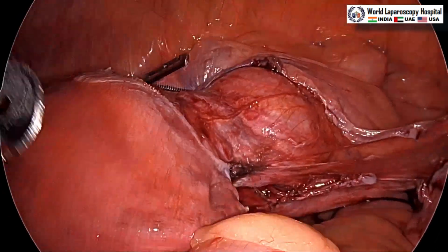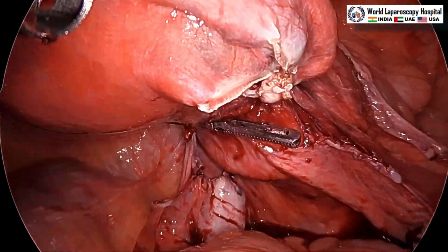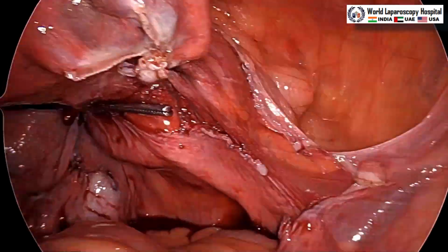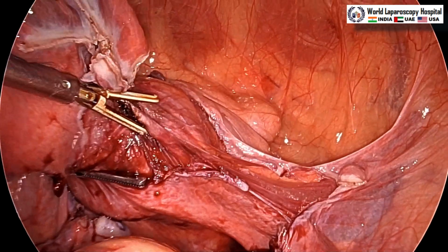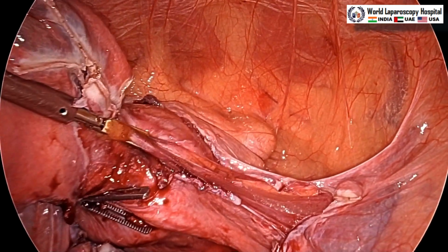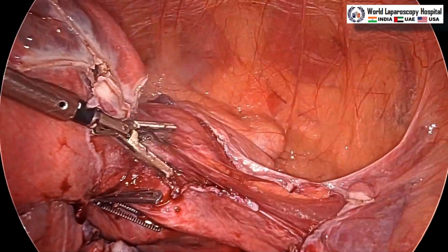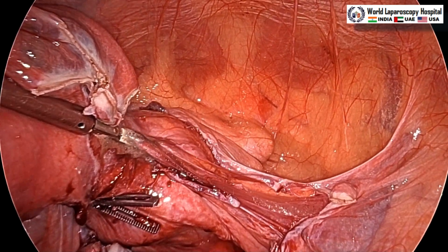Assistant role is crucial here because if you are doing it with only 3 ports with the ipsilateral, then you need a good traction contralateral so that you can take the uterine artery sufficiently. Ideally, for beginners, for the right side uterine artery, they should make one contralateral port and they should take this side of the uterine artery from the opposite side.